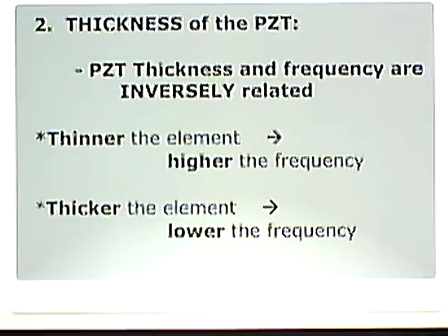So let's talk about the thickness of the PZT. How does that affect the frequency of sound that is produced when that electrical current hits it? The thickness and frequency are inversely related. All right?